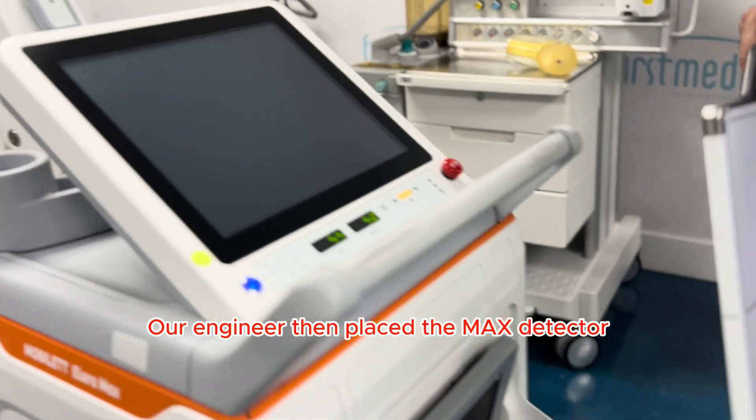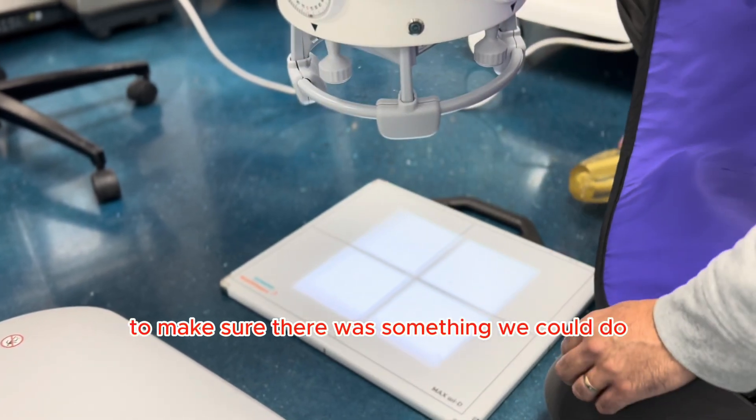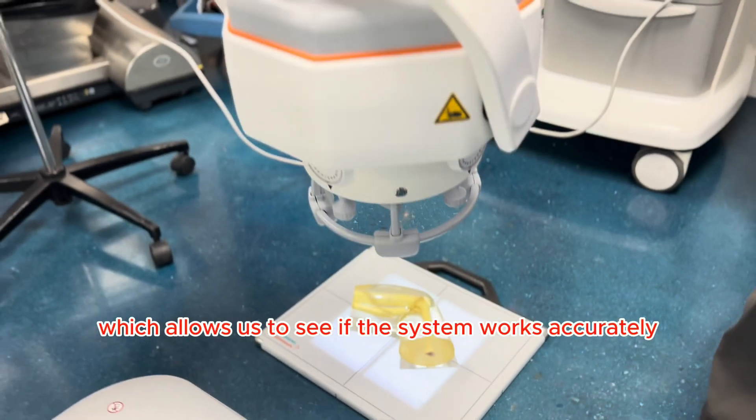Our engineer then placed the max detector with its integrated handle on the floor and an imaging phantom on top of it to make sure there was something we could do the test on. Phantoms are objects that stand in as human tissue, which allows us to see if the system works accurately.